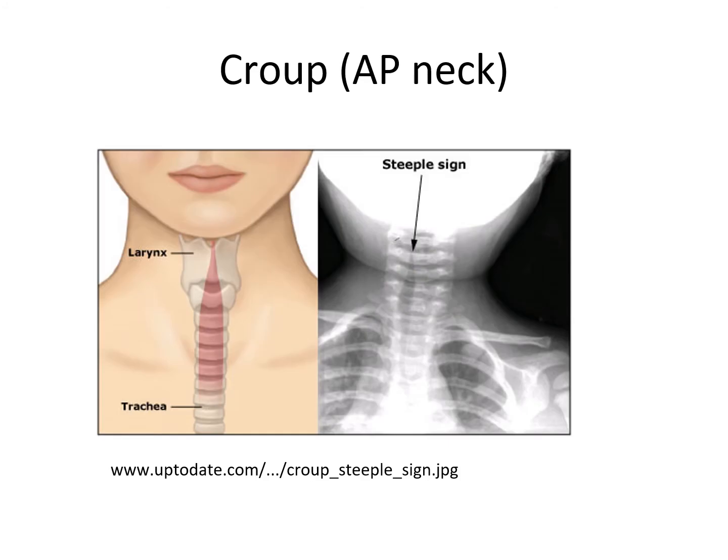Another view that they can do with x-rays that isn't per se a chest x-ray, but a neck view, is definitely respiratory related. It's used if you're evaluating a patient for croup, which is more common in children. With croup, the larynx area gets swollen, and the telltale sign is the steeple sign.